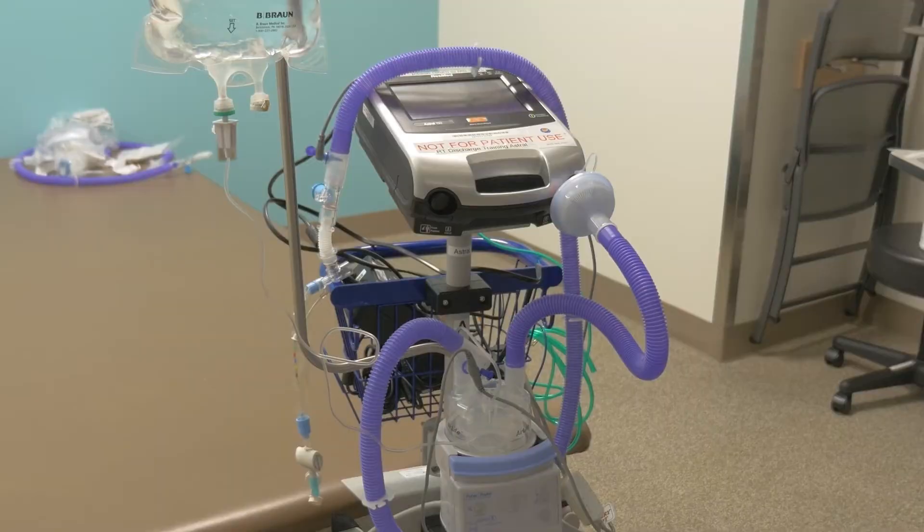If your child uses a home ventilator to help them breathe, you'll have monthly responsibilities to keep the equipment clean and safe. Every ventilator needs to have its circuit changed on a regular basis. Your doctor and home care medical equipment supply company will tell you how often to do this.